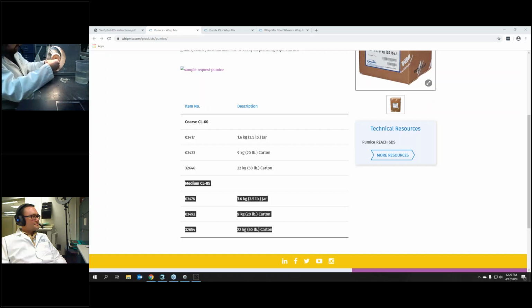All right. So I'm just going to keep hitting it with the pumice. And already, it's starting to turn into a transparent state. It's kind of hard to see. I should probably get something so I don't drape it on top of the laptop. All right, so you can already see it's starting to get transparent. So I'm going to continue going with that pumice.